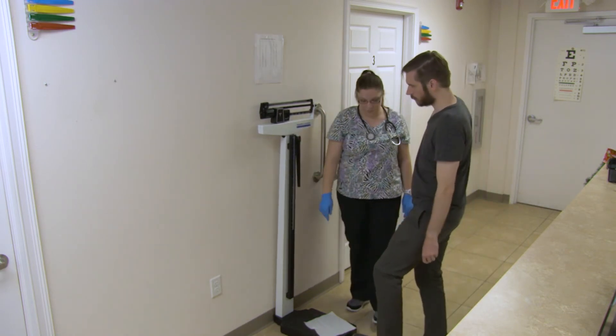Assist the patient to step off the scale, allowing them to sit and put their shoes back on if necessary. Accurately document the procedure in the patient's medical record.